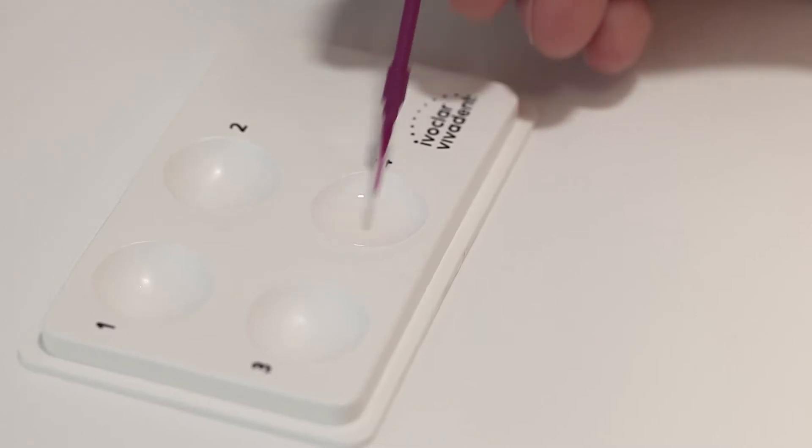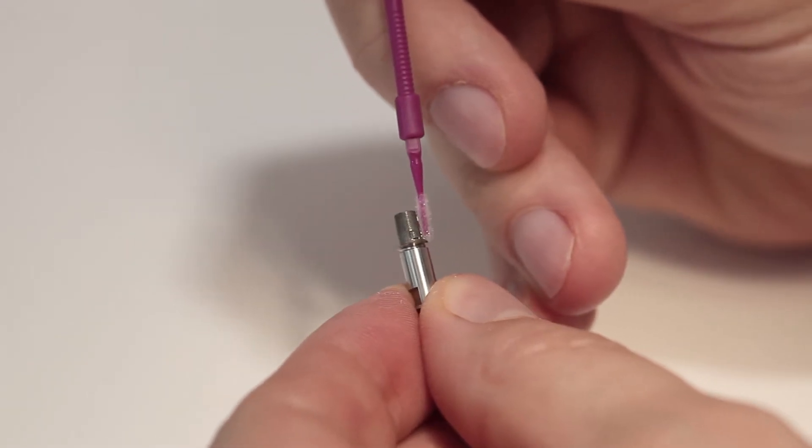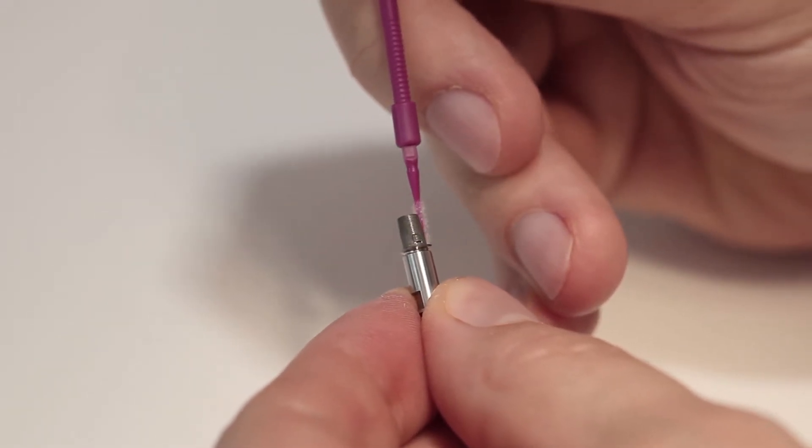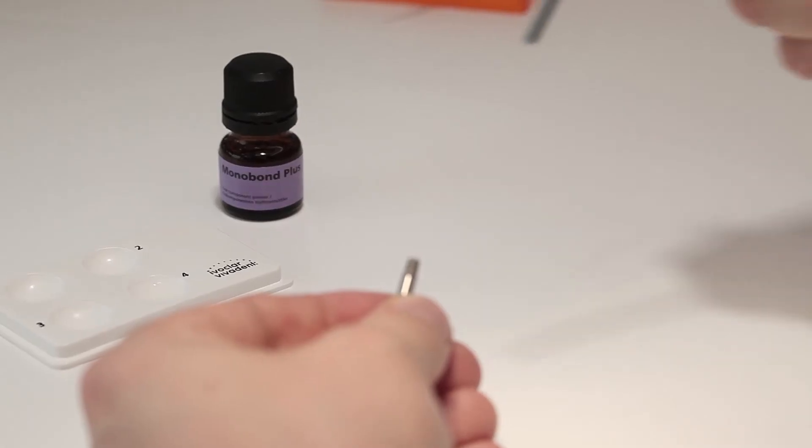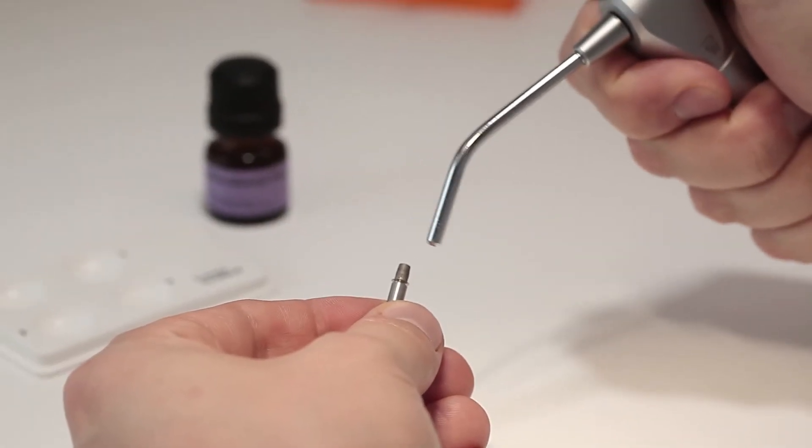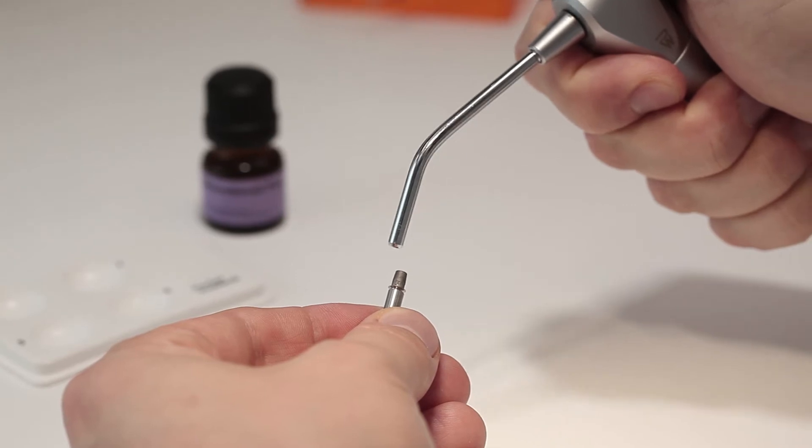Apply monobond plus bonding agent to the dry bonding surface of the tie base and allow to react for 60 seconds. Then evaporate any remaining excess with compressed air that is free of water and oil.